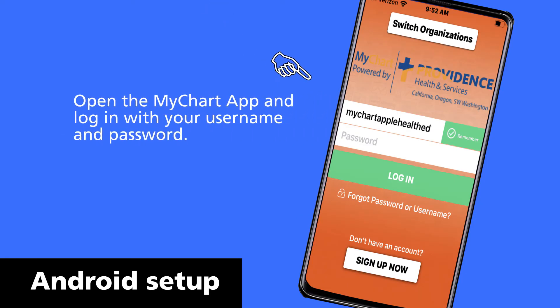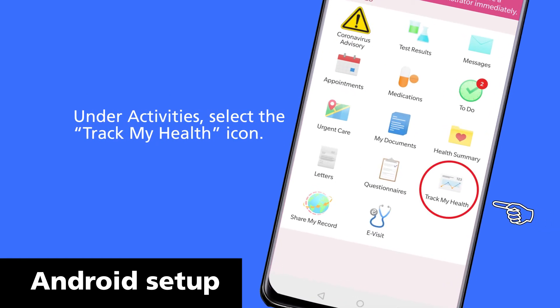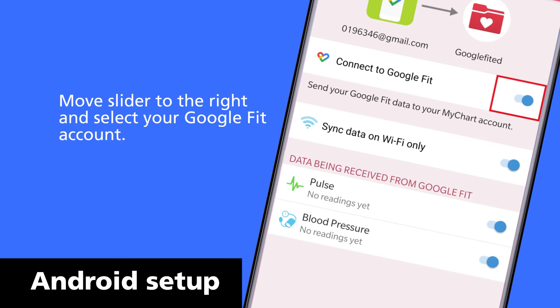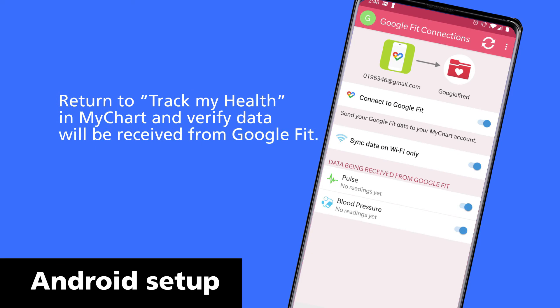Now, open the MyChart app and log in with your username and password. Under Activities, select the Track My Health icon. Once you are in Track My Health, click on the Connect to Google Fit button at the bottom of the page. Move the slider to the right and select your Google Fit account. Return to Track My Health in MyChart and verify data will be received from Google Fit.